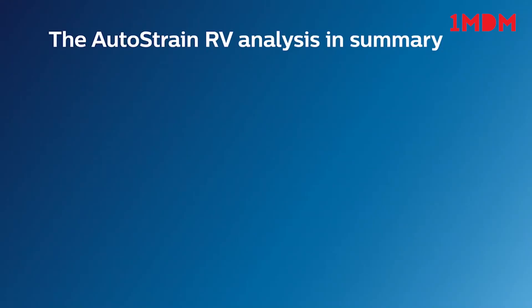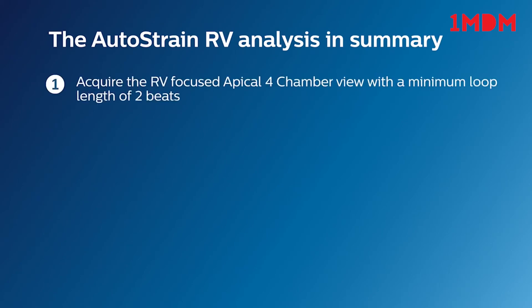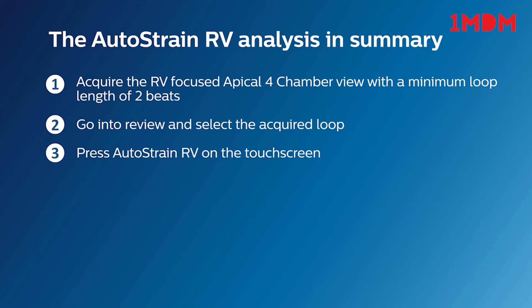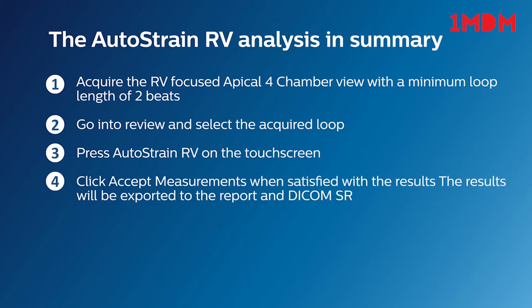Summarizing the right ventricle auto strain analysis: acquire the RV-focused apical 4 chamber view with a minimum loop length of 2 beats. Go into review and select the acquired loop. Press Autostrain RV on the touch screen. Click Accept measurements when satisfied with the results. The longitudinal strain results will be exported to the report and DICOM structured report.